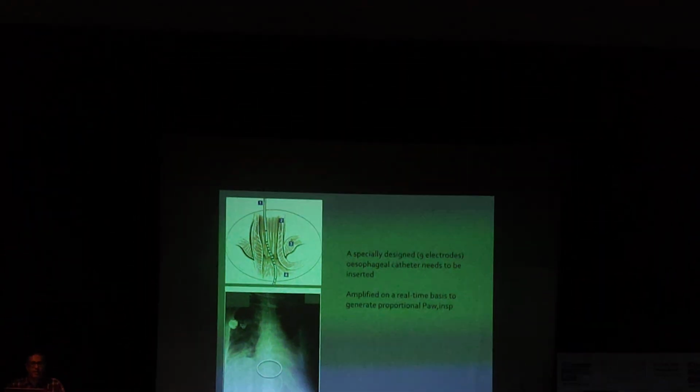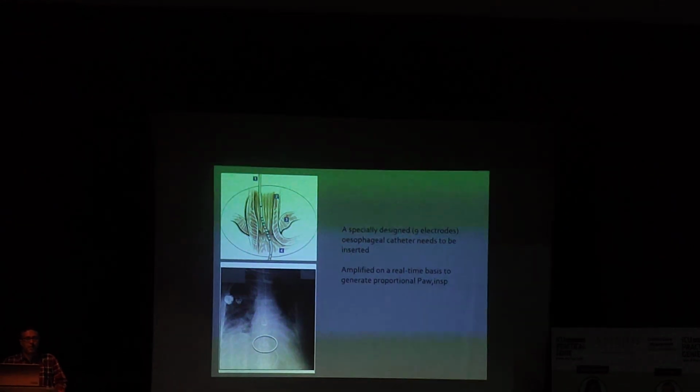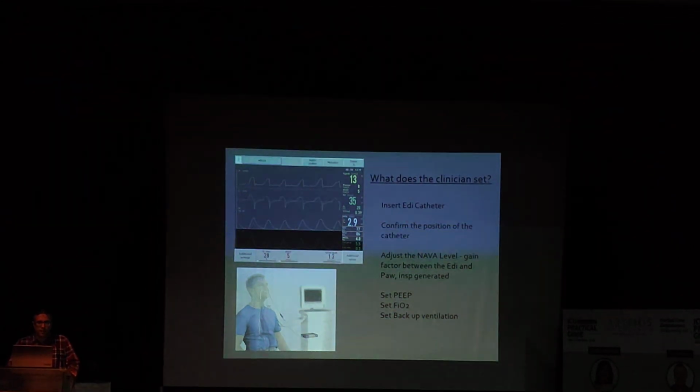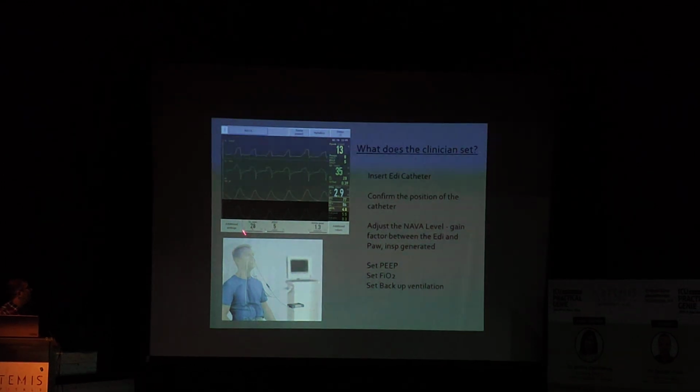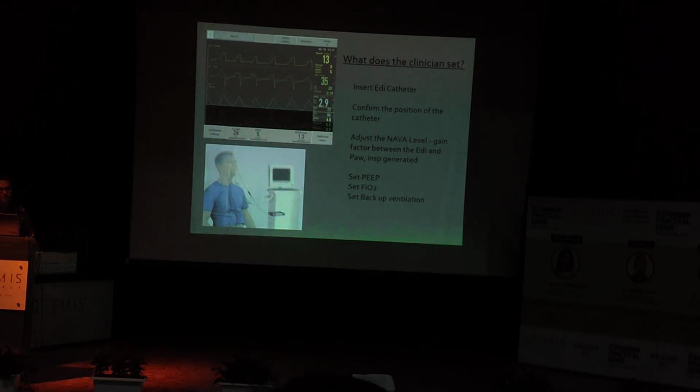A specially designed 9-electrode esophageal catheter needs to be inserted, and what it does is amplify the signals. So this is how the waveform looks. This can be asked in the exam. Can you all see?